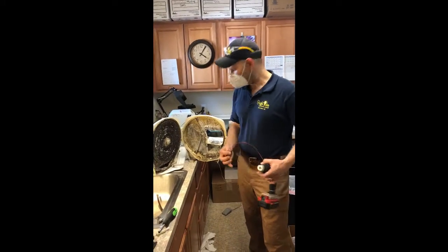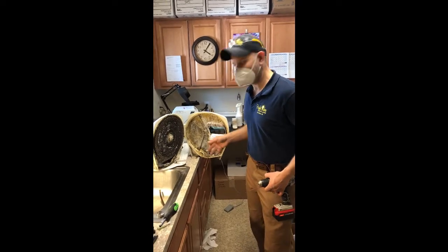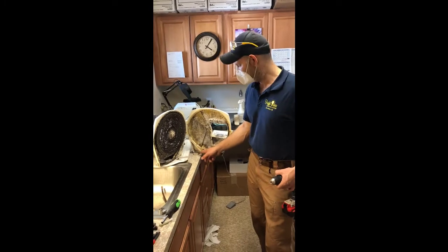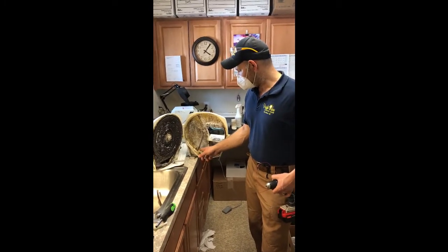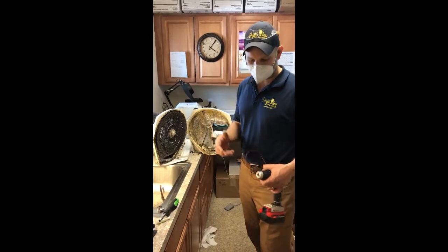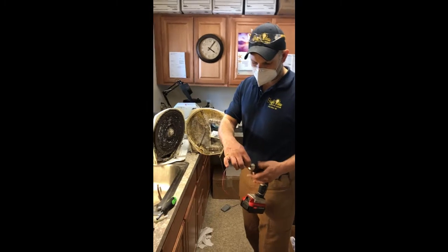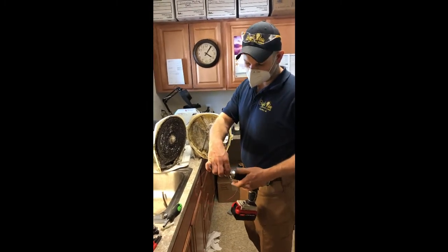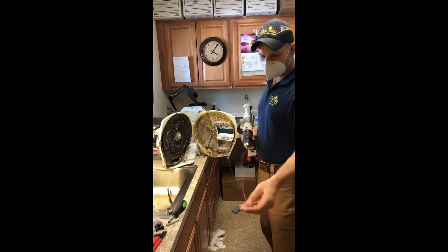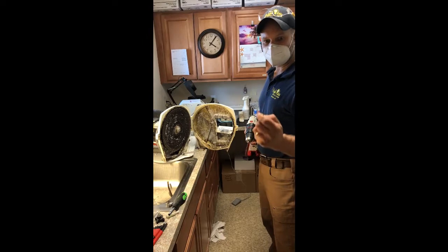Okay, so what we've got here is we went ahead and have done everything that we normally do to clear these. It appears there's a blockage in there. The main issue is basically reaching the blockage with enough of a force to dislodge it. The way that I've done before is with a coat hanger and a drill. All we're going to do is chuck up a piece of solid core wire, and then we can basically spin the wire in a manner like a drill bit.